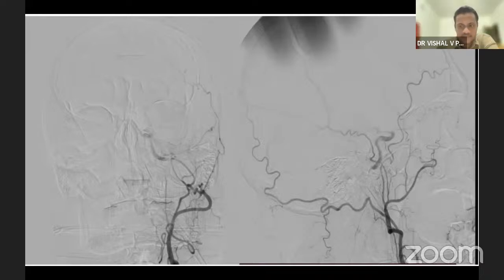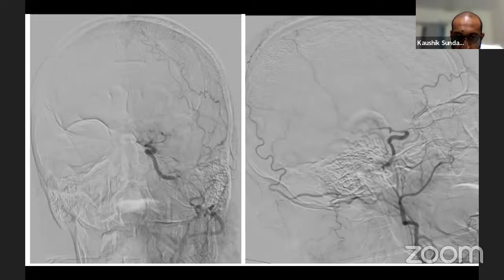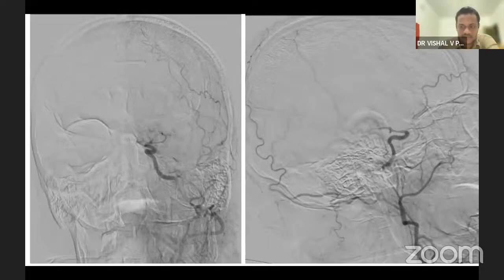Okay. Can you go to the next slide? Can you see that now? I think you are able to see those carotids coming all the way down, and possibly there is a thrombus over there somewhere. I can't see. Anyways, so this gives you an idea. Okay, next slide.